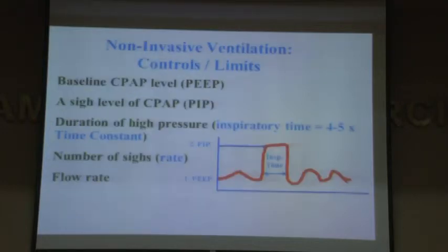Now, let's look at how we deliver NIPPV. One, you set the baseline pressure, which we call PEEP, and then the higher pressure, the peak inspiratory pressure.